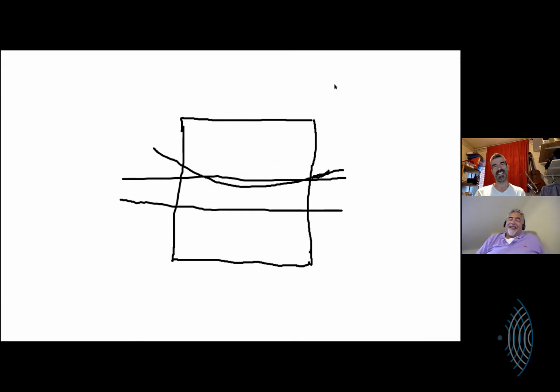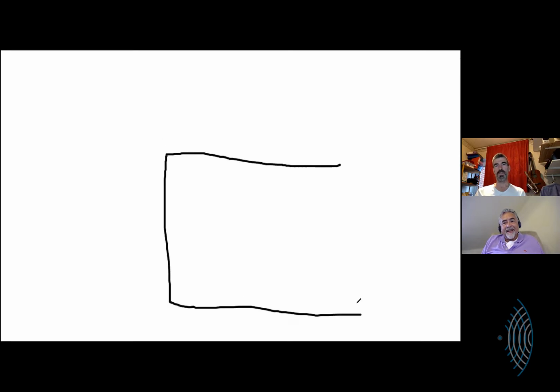So keep going now. Yeah. No, but so that is, so Doppler is quite complicated, and the physics is quite complicated. But you're just saying keep the power Doppler off, throw on the color Doppler, take it up to where it totally covers the square and then back it off. What is your technique?